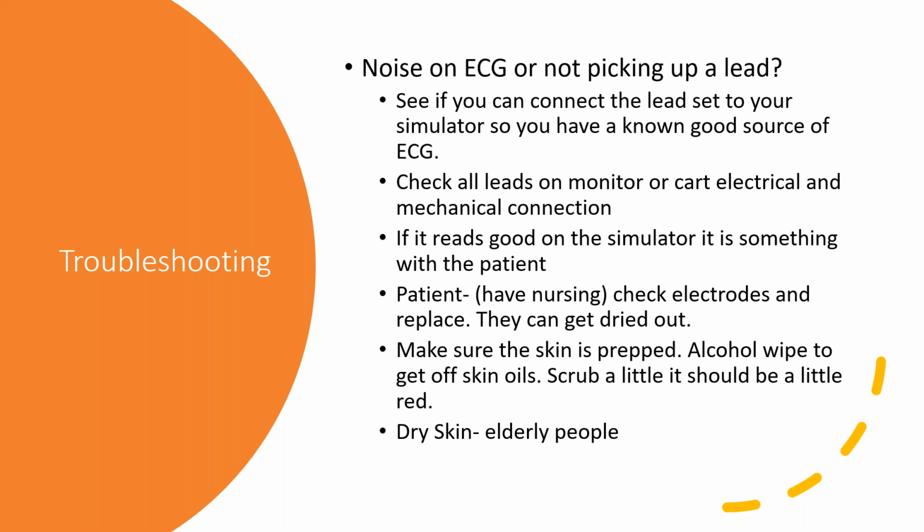I had no hair left, so I didn't have to worry about hair being in the way. Elderly people get very dry skin, so sometimes dry skin can cause artifact also. Having your ECG simulator and being able to test your ECG leads on the patient, you can eliminate the patient or the monitoring system pretty quickly with that ECG sim.